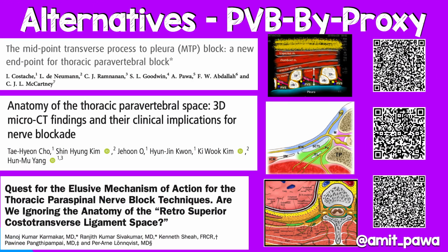I do want to highlight here the alternatives looking at this whole concept of paravertebral by proxy, saying, well, you know what? Actually, maybe you don't actually need to be in the paravertebral space, so deep to the superior costotransverse ligament, in order to get a successful paravertebral block. And that's where this whole concept of the MTP, or now known as the intertransverse process plane block, came from. We noticed that local anesthetic deposited behind the superior costotransverse ligament in the intertransverse tissue complex still resulted in analgesia and pleural depression. And there have been a couple of other papers and discussion points that will expand your knowledge if you look at those QR codes.